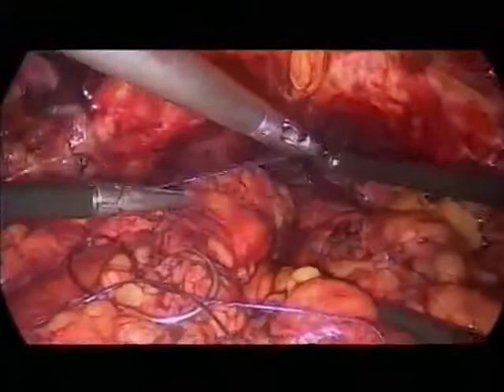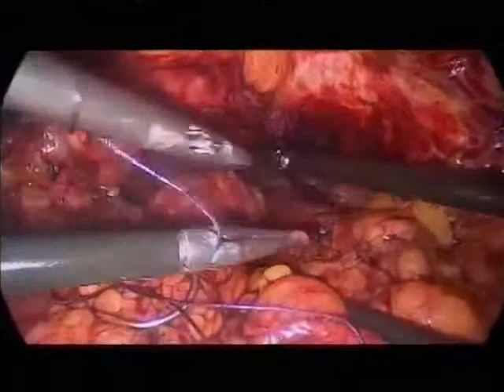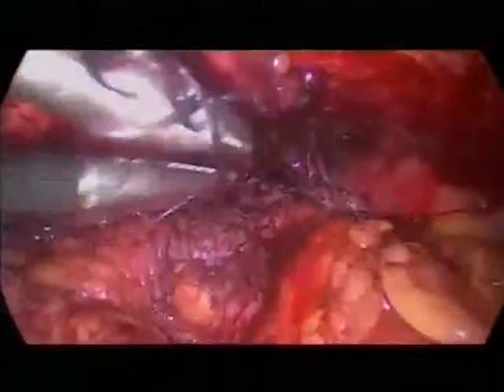So this was the 11 o'clock stitch, and the final one is the 1 o'clock stitch. But we will fix these stitches also on the symphysis. I show you. So that way we fix the urethra and the new bladder neck. Hold this.